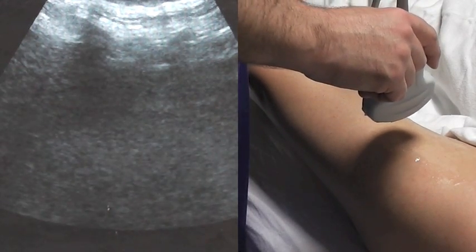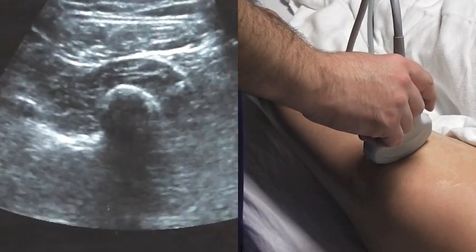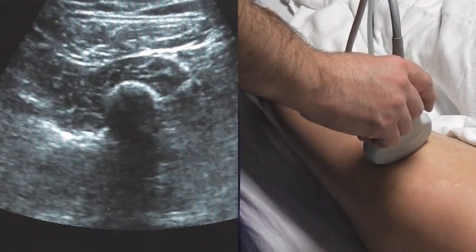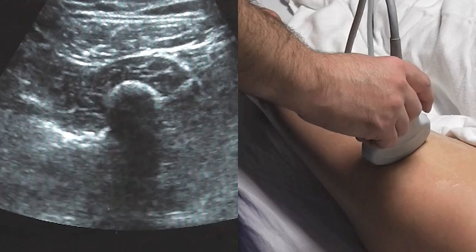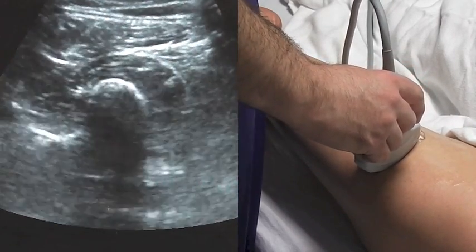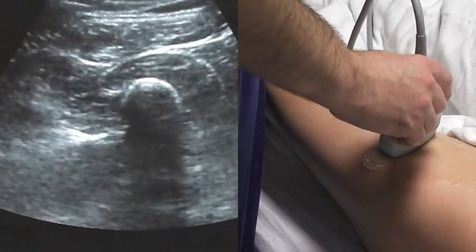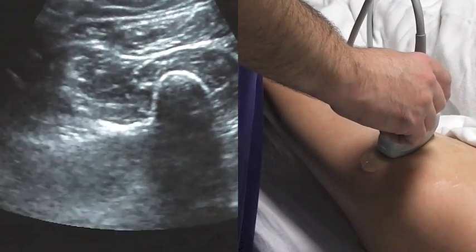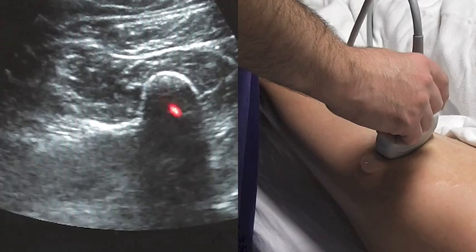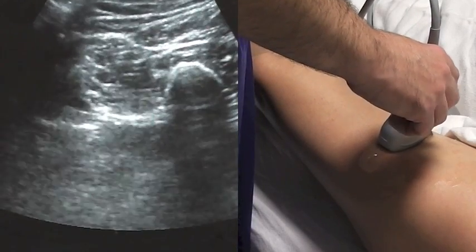I start by placing my probe down on top of the femur about mid-thigh. There are three main structures when doing this block that you need to identify to have a quick, easy, safe, and successful block. The first is the femur — this is very easy, it's sitting right here, very prominent and almost always very easy to see.